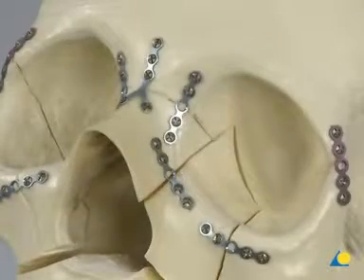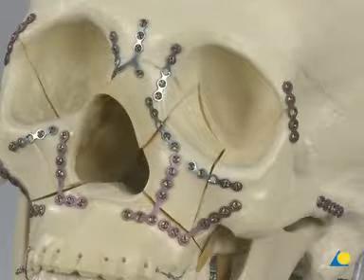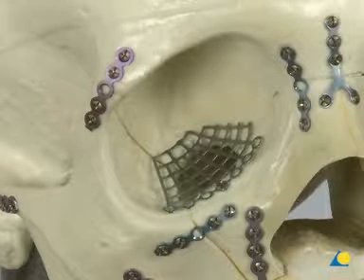To repair the mid-face fractures, 0.5 mm and 0.7 mm thick adaption plates and a 0.5 mm thick Y plate are needed. 0.7 mm thick L plates are used for the LeFort I fracture. The orbital floor defect is repaired with a 0.3 mm thick orbital floor mesh plate.